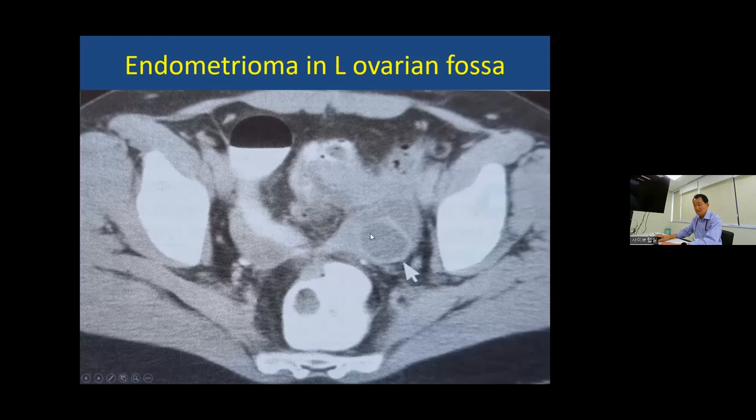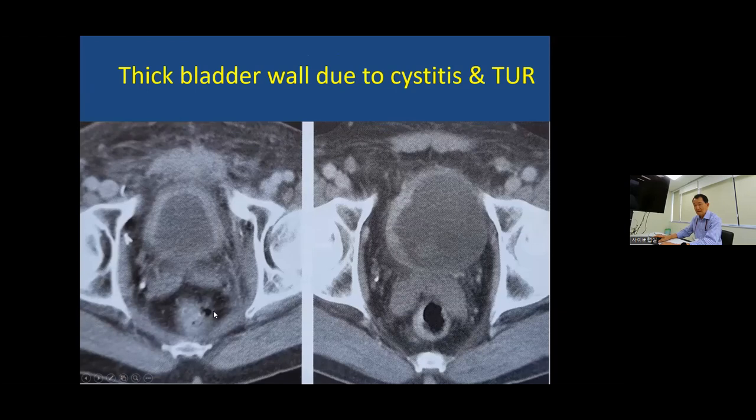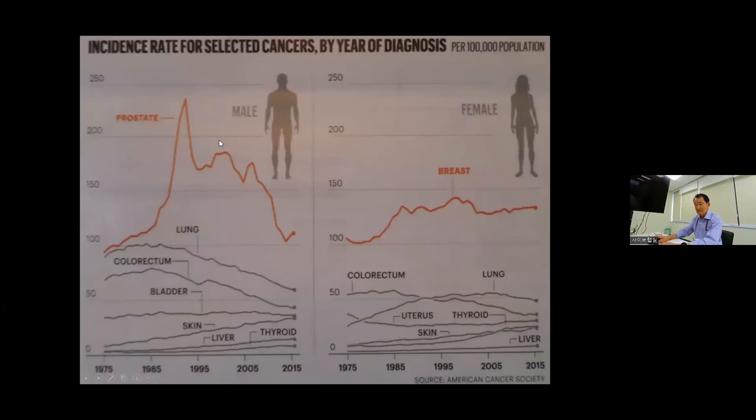And some cyst. Anytime you have things, it's ovarian mass or endometrial. Bladder here has some diverticulum, an anatomical variation. But your bladder wall is a little thickened, and this seminal vesicle is thickened. This side is supposed to be normal, but when you see this, you have to think about inflammatory conditions or cancer. Nodular things are certainly cancer, bladder cancer.